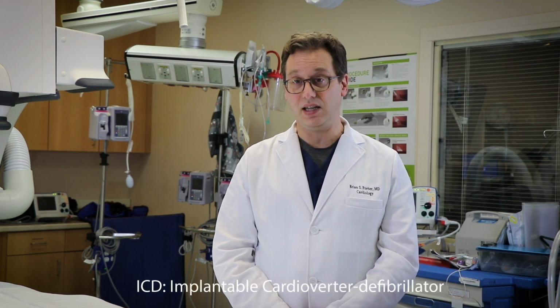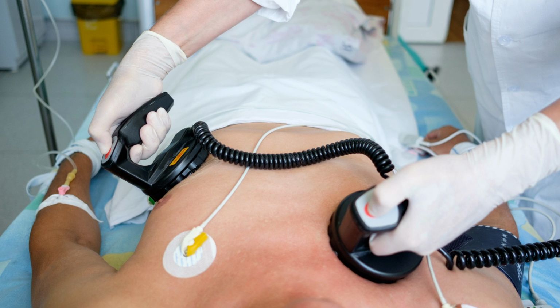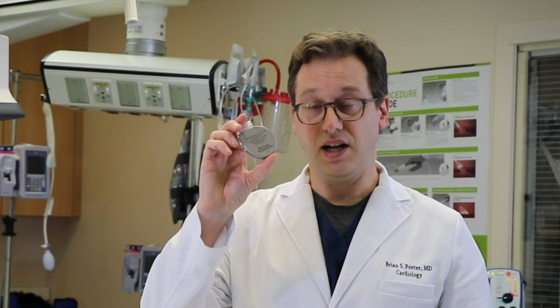So in the course of your workup, you and your cardiologist may determine that rather than having a heartbeat that's too slow, you have a heartbeat that's too fast. That could be a tricky problem to solve, but we can generally solve it either with medications or certain medical procedures. One of those medical procedures that I wanted to talk about today is the insertion of something called an ICD, which stands for Implantable Cardioverter Defibrillator. A cardioverter defibrillator is something that you might have seen on television or in movies, where a patient is on the gurney and not doing very well, and the doctor will come up to them with paddles and give them an electric shock. An implantable cardioverter defibrillator does much the same thing, but with a small device that looks just like this, that's implanted under the skin.